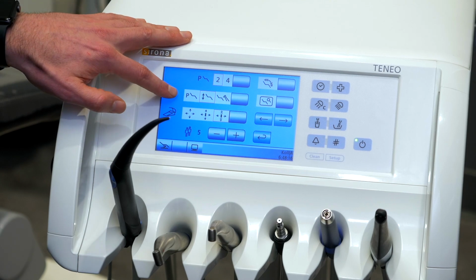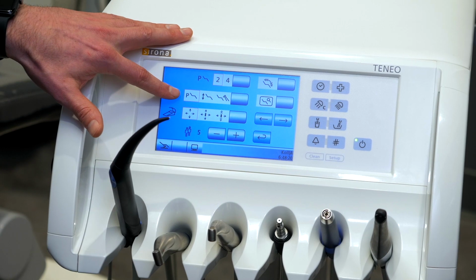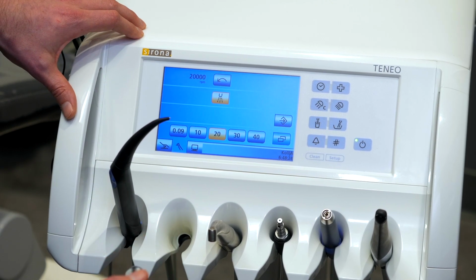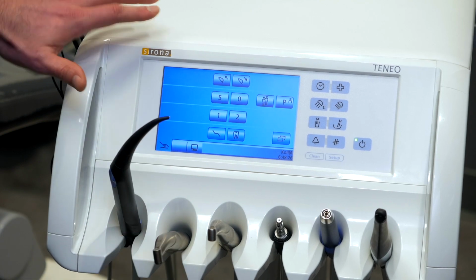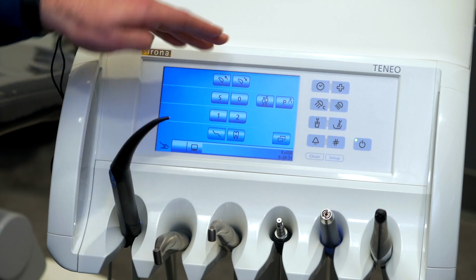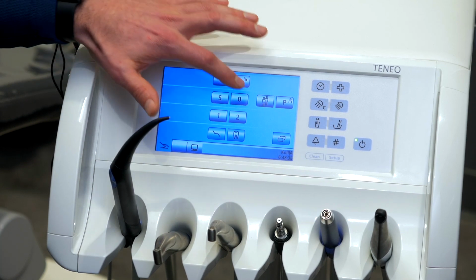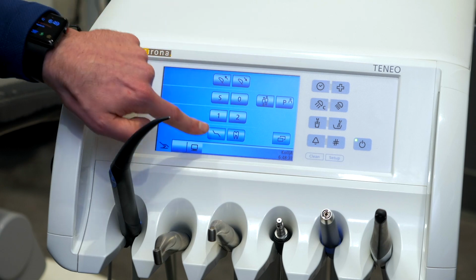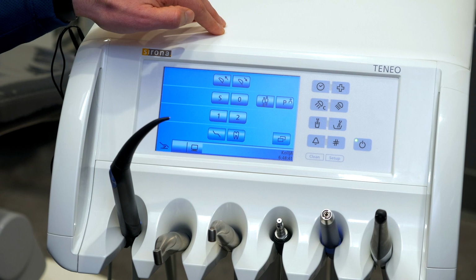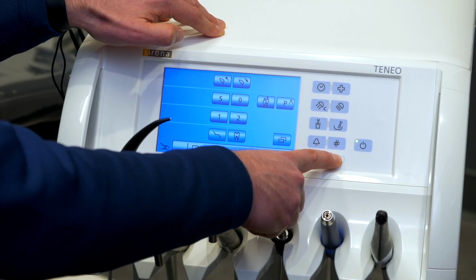The next row of buttons here, the first one customizes your user interface to simple mode. When simple mode is activated and I take an instrument, I go to my home screen here, and you can see it's very simple. There's only a couple rows of buttons. You have headrest control, S0, 1, 2, and all of your other chair movements and your clinical functionalities are underneath subsequent menus.